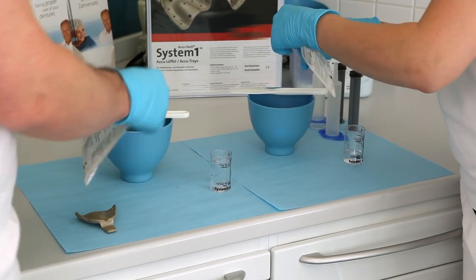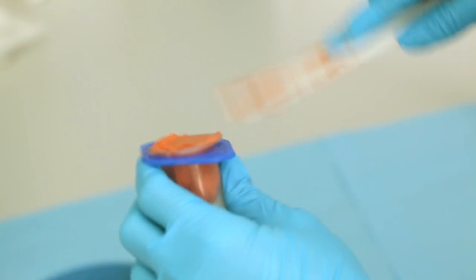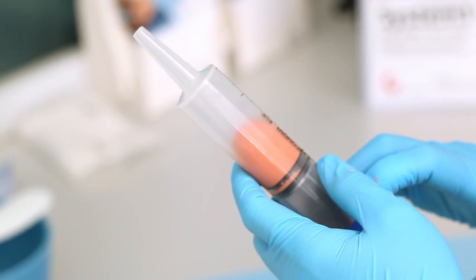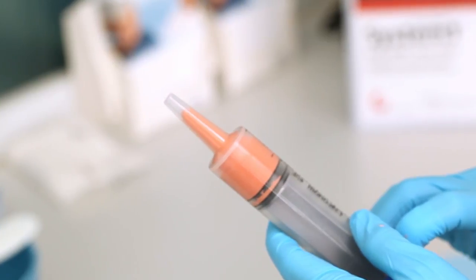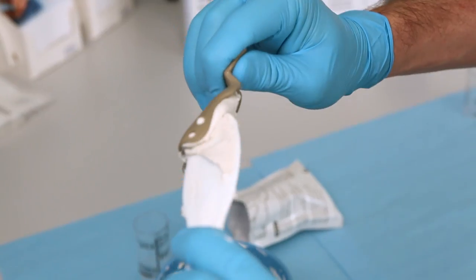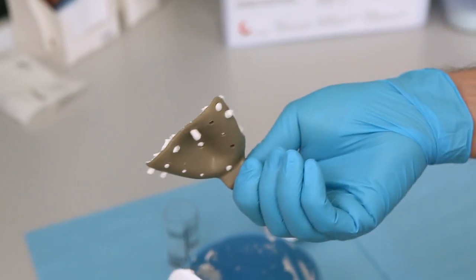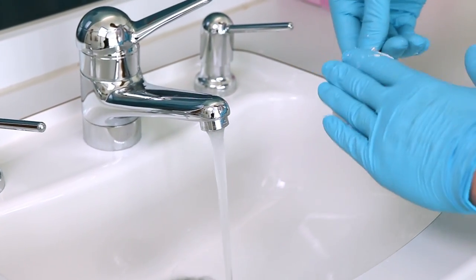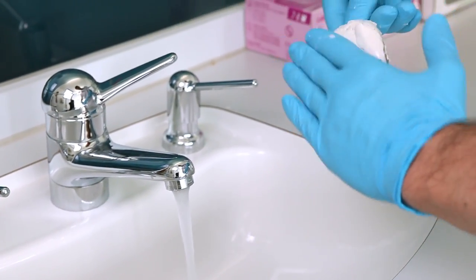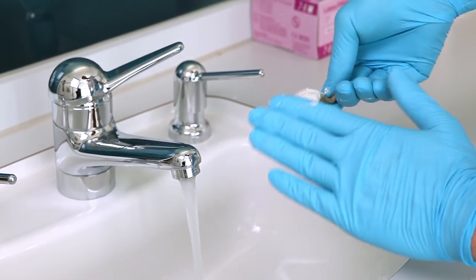Mix the impression materials according to the manufacturer's instructions. Fill the application syringe with low viscosity material, then load the tray with high viscosity material. Make sure that you press the material through the retention holes of the tray well. Use cold water to give the impression material a wedge-shaped design so that you have more material in the anterior region and less in the posterior region.